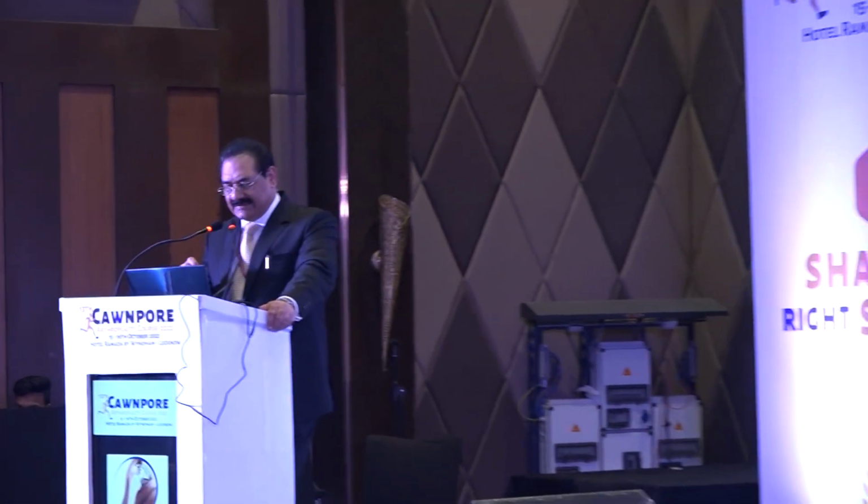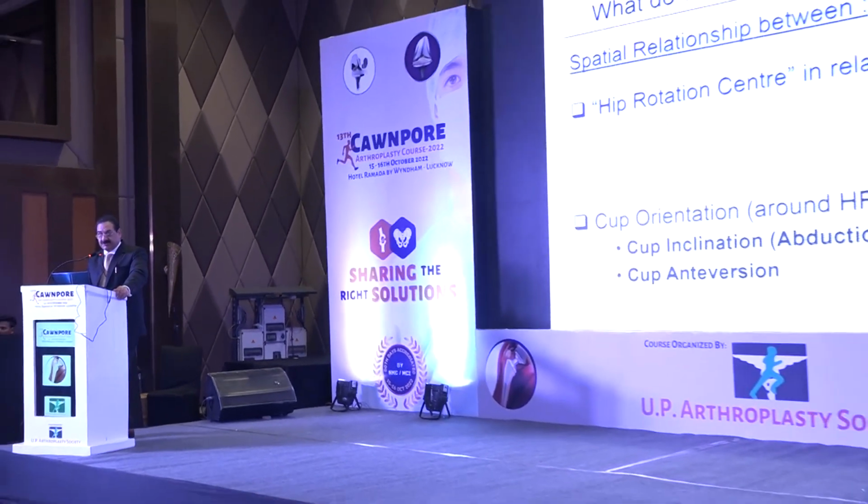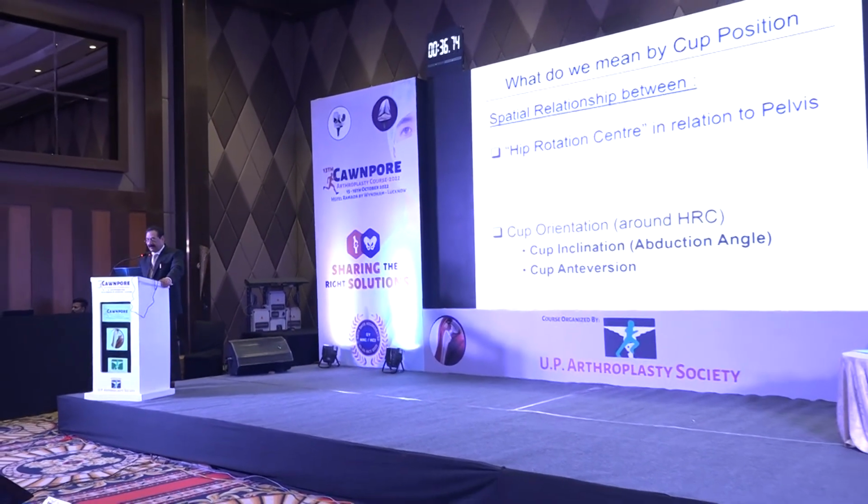I bring greetings from my 2 institutes. And why do we need optimal cup position? It is for improved hip function and longevity. Now when we talk of cup position, what do we mean by cup position? We talk of 2 relationships of the cup. 1, hip rotation center in relation to pelvis. And 2nd, cup orientation, which could be inclination or cup anteversion.